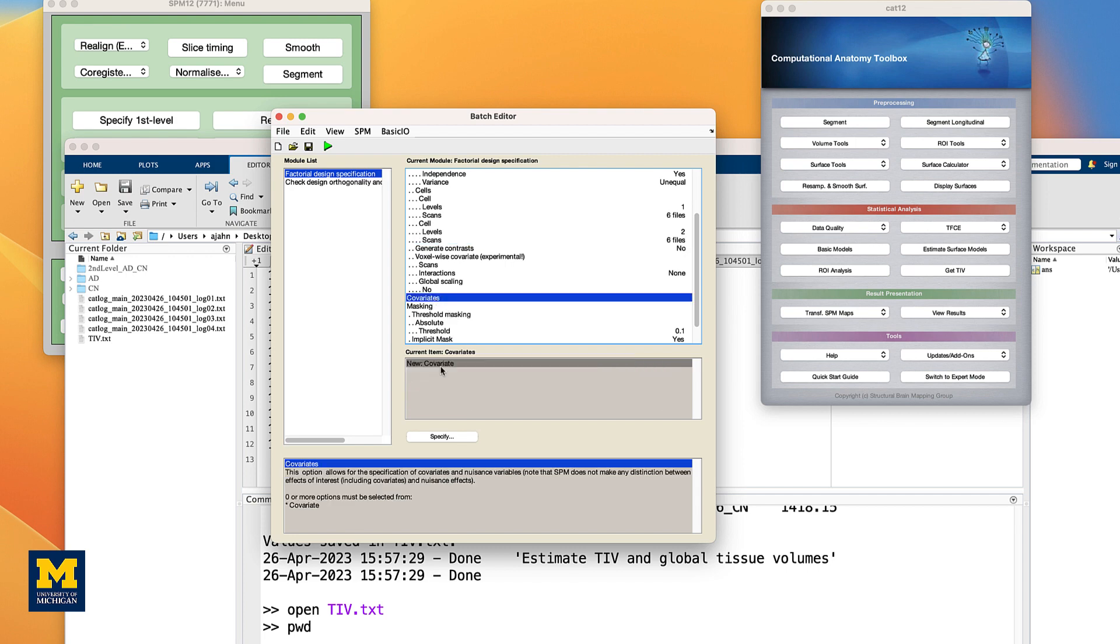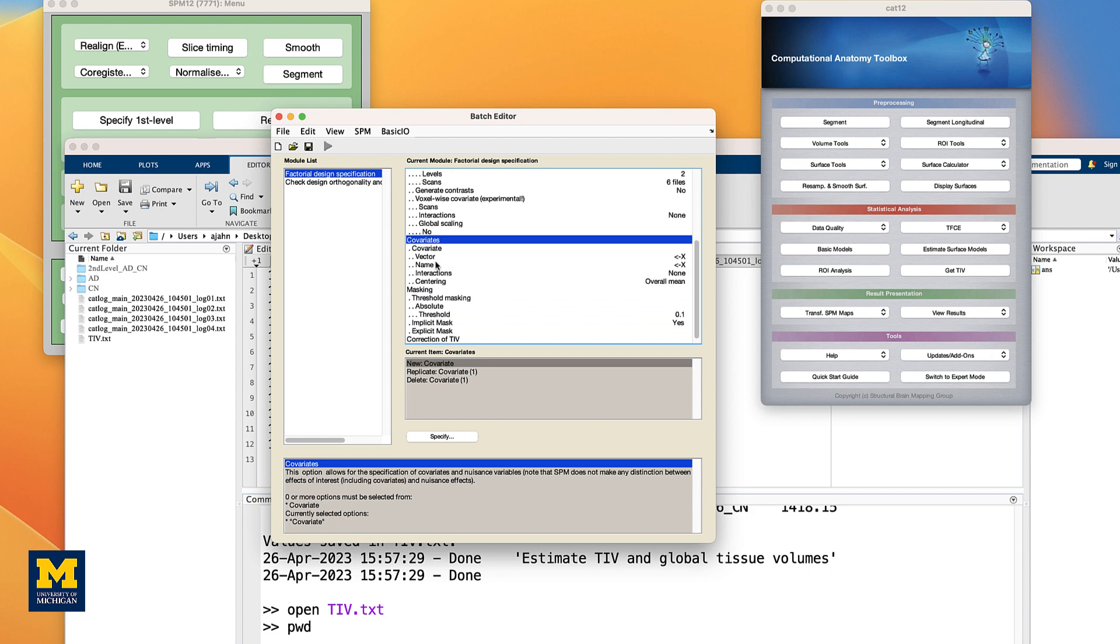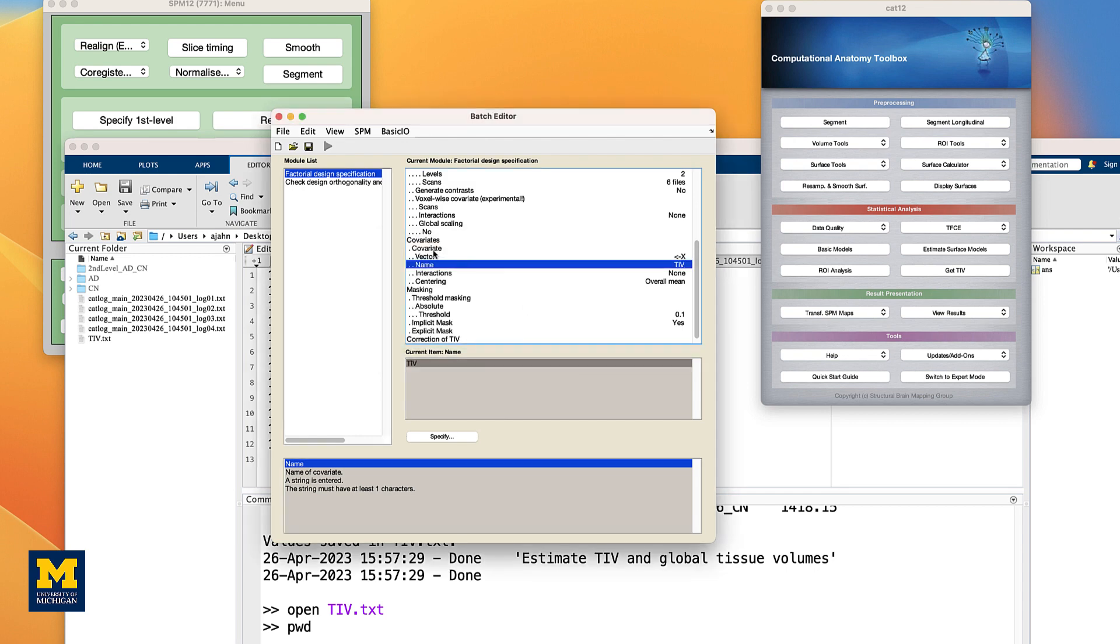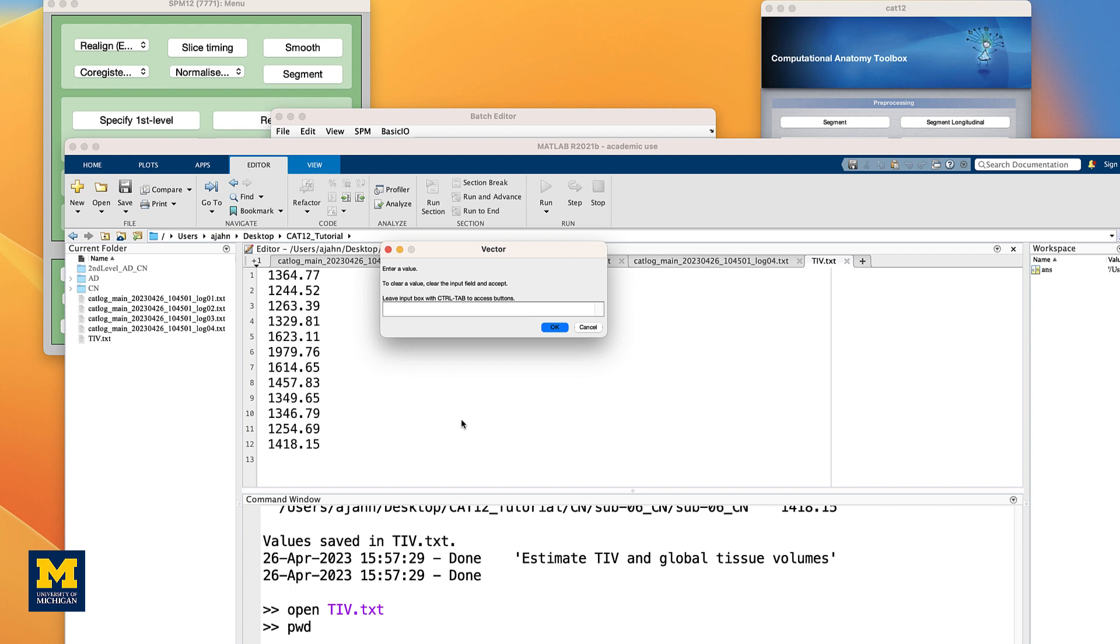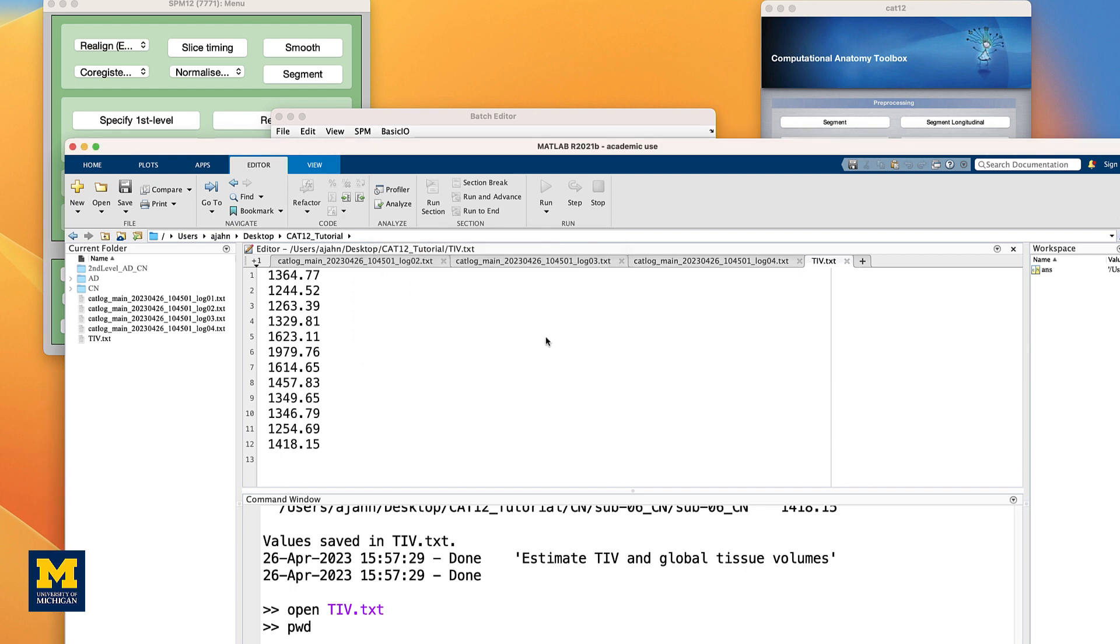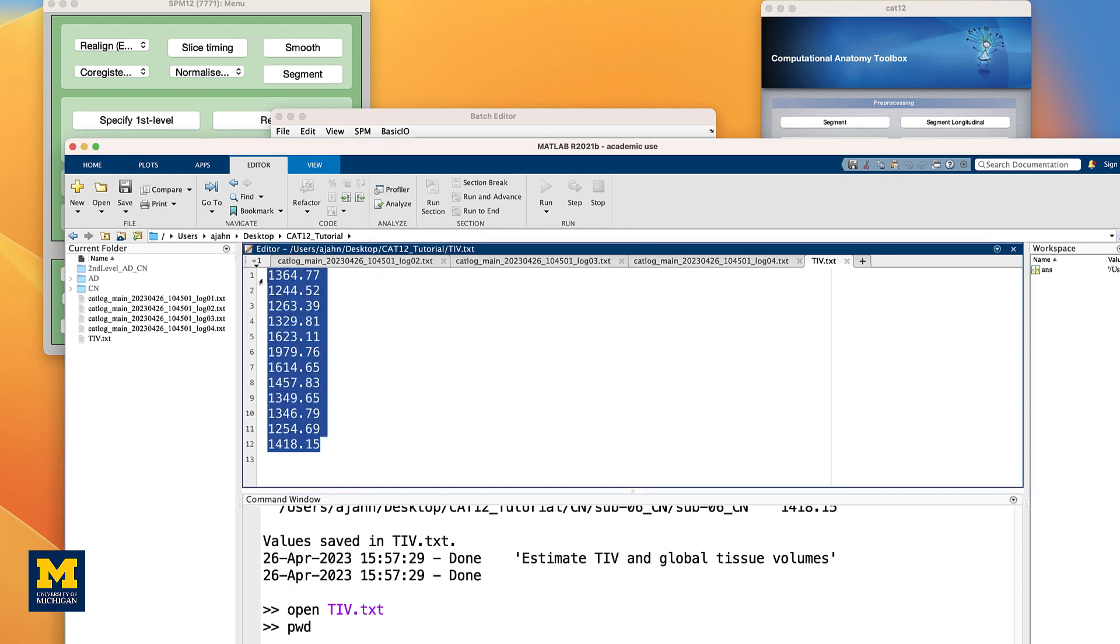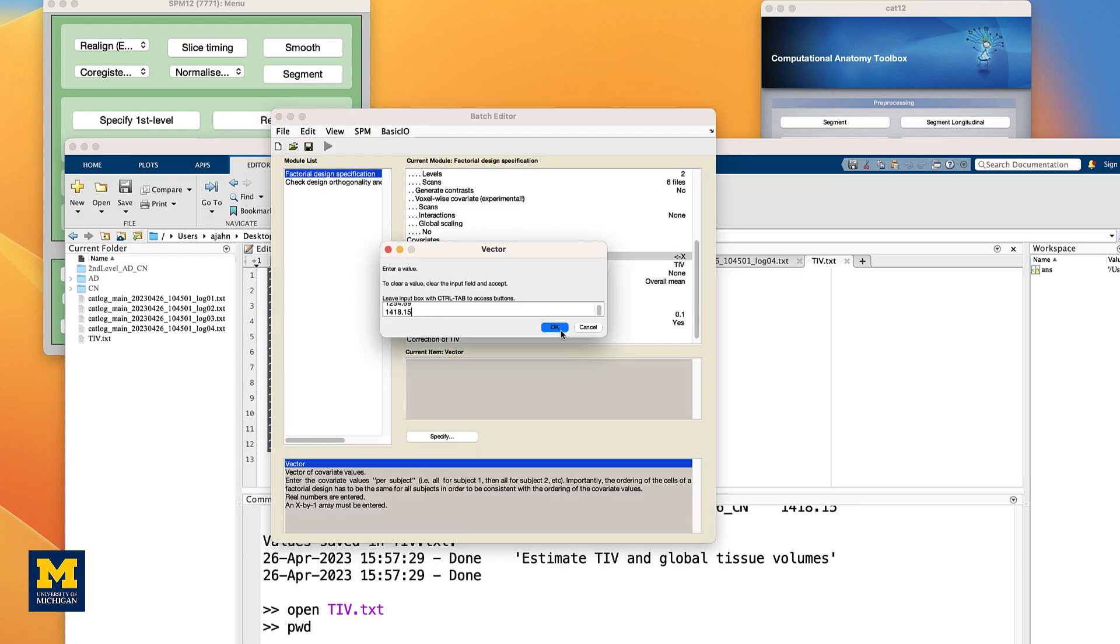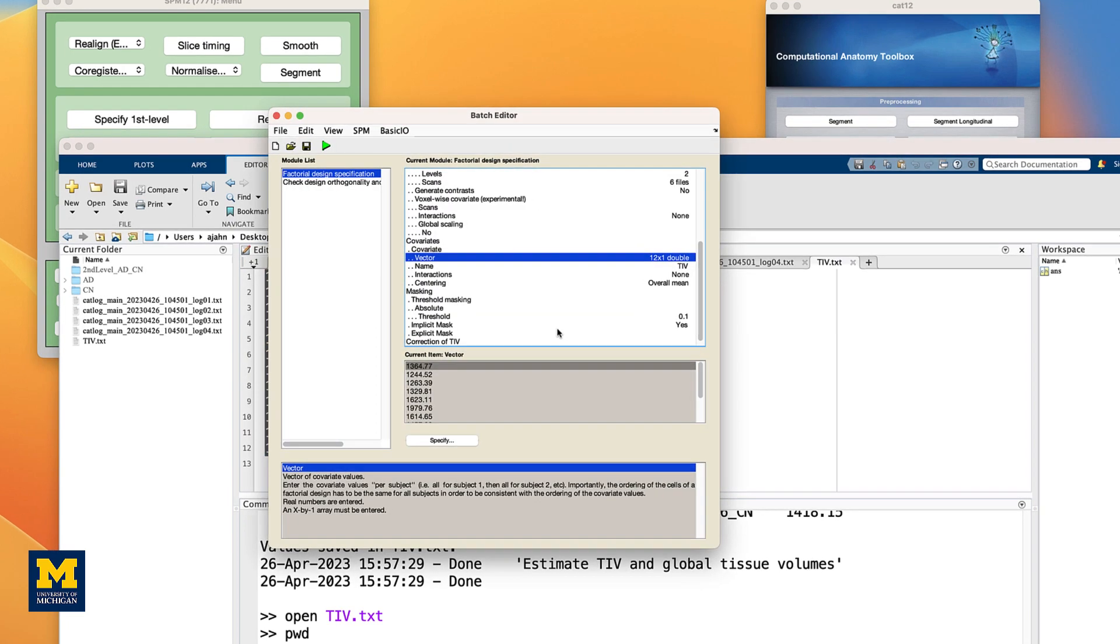In the Covariates field, if we scroll down, select New Covariate, and double-click on Name. Let's call the covariate TIV for Total Intracranial Volume. Then, double-click on Vector, and copy and paste the values from the TIV.txt file you generated. Leave the rest of the defaults as they are.